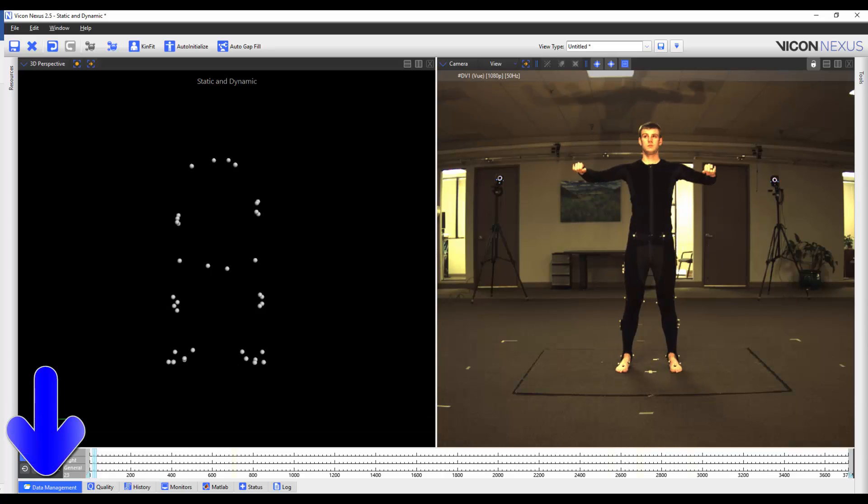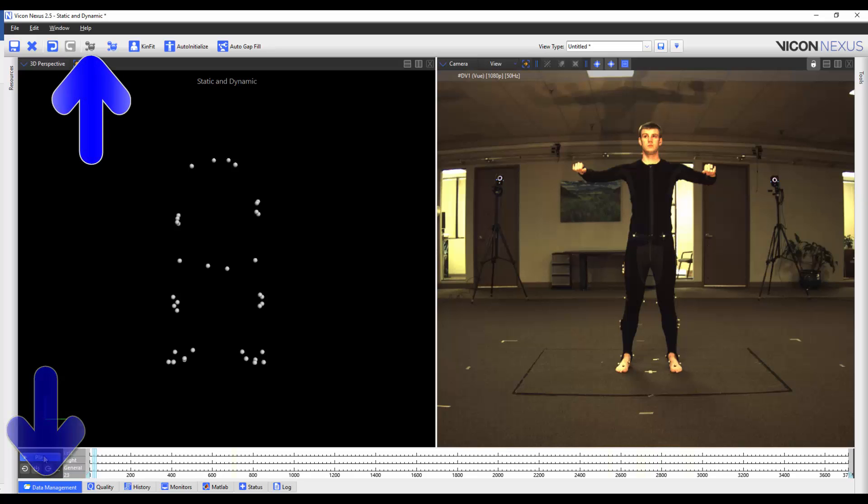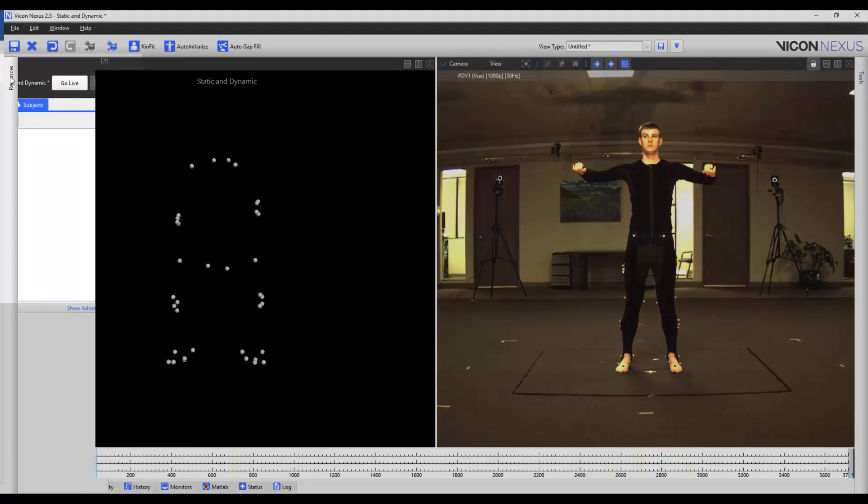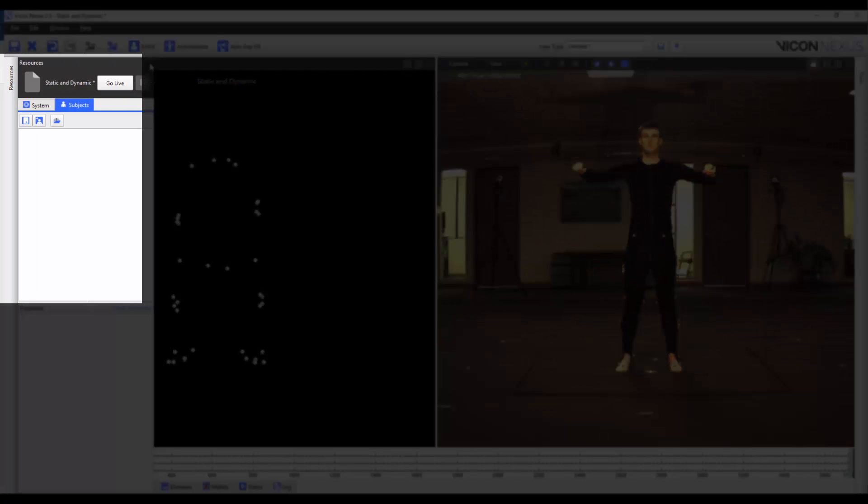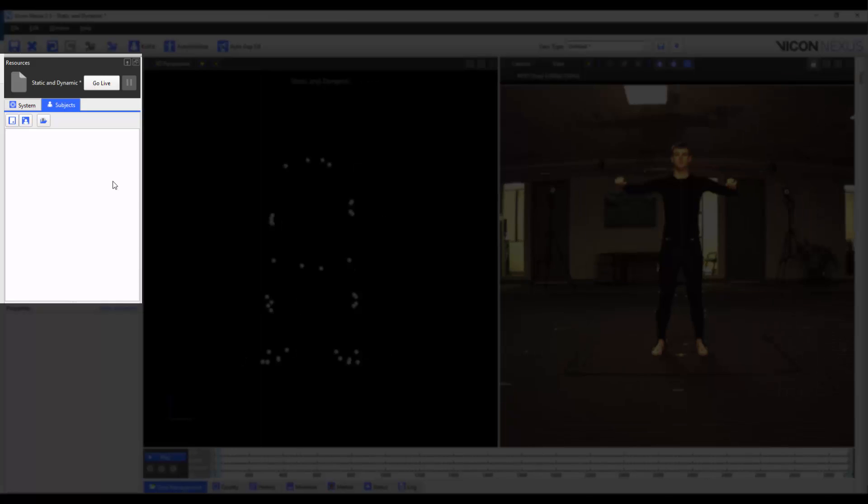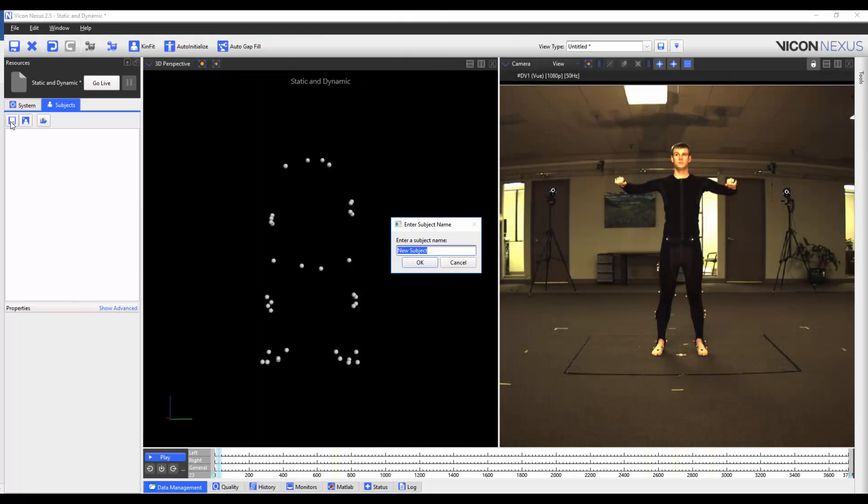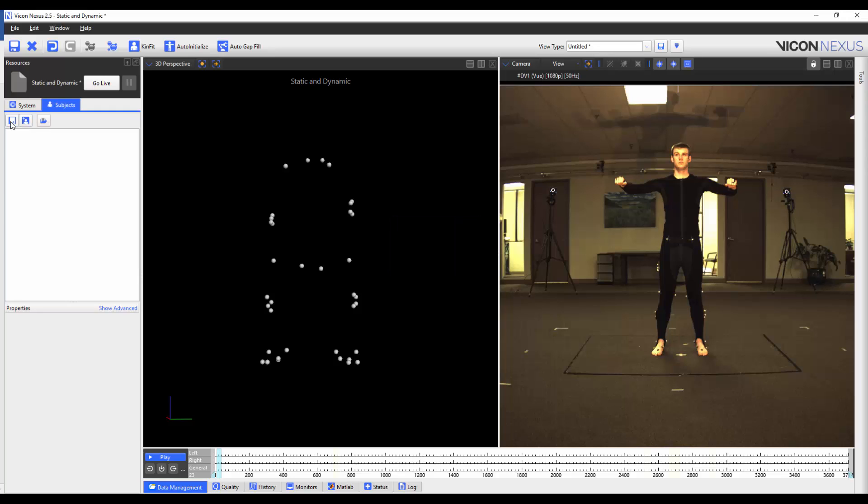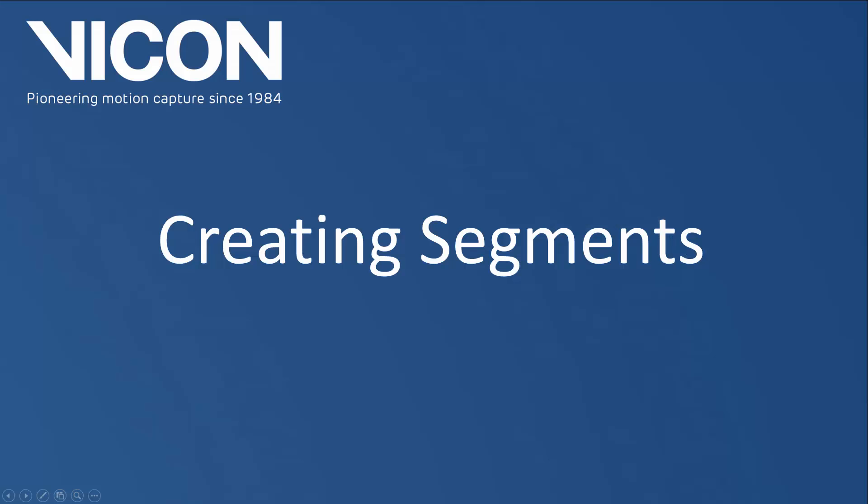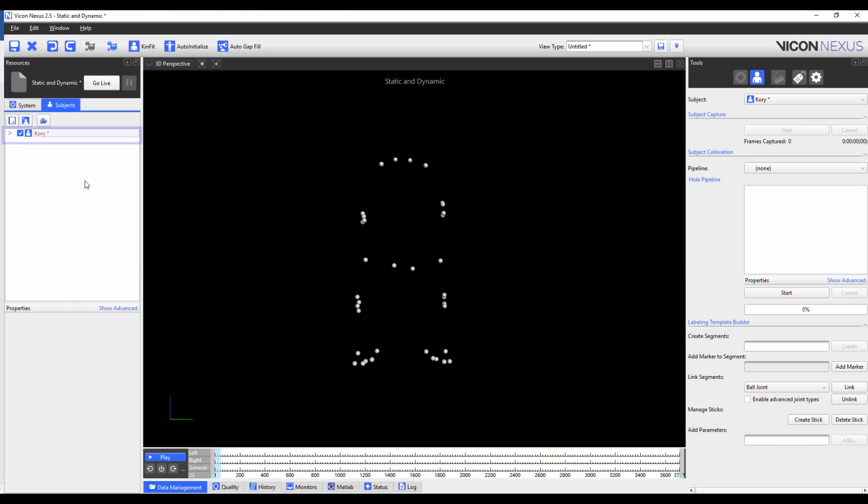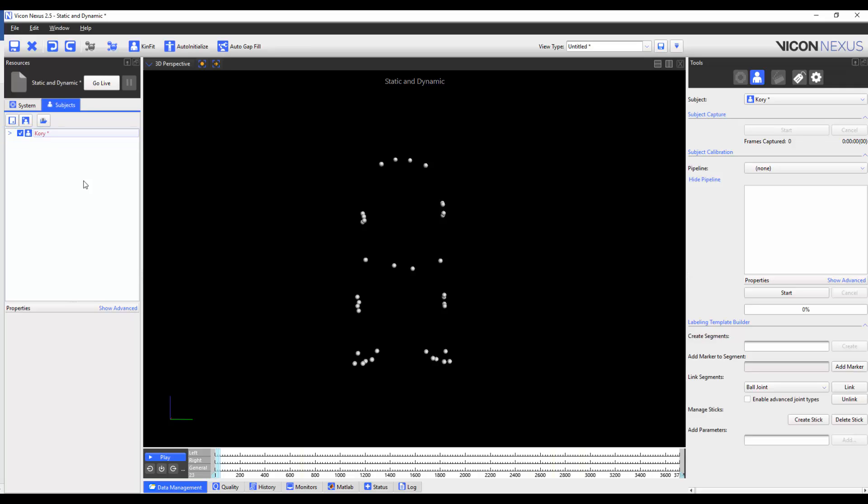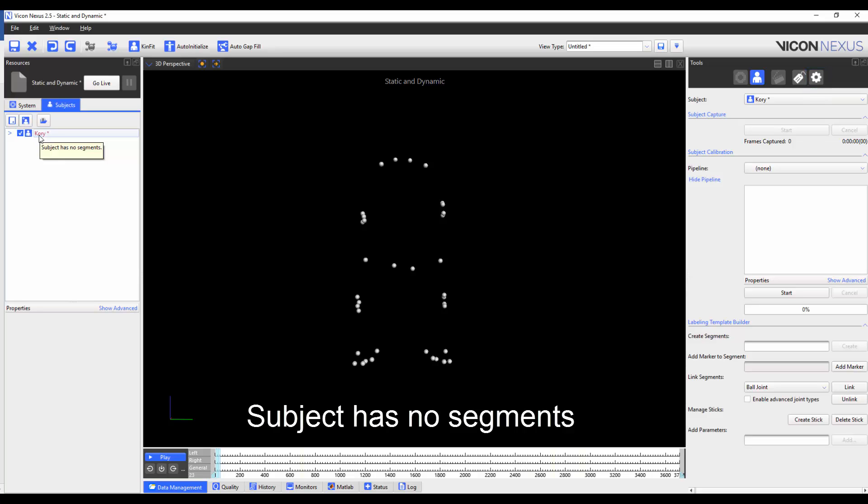I've already loaded the trial from my data management and reconstructed it. I'm also going to load a blank subject from the Resources pane, Subjects tab. We can see that the subject name in the Resources pane matches the subject name in the Tools pane. The subject's name in the Resources pane is red. When we hover our mouse over the subject's name, we get a tooltip saying that the subject has no segments.